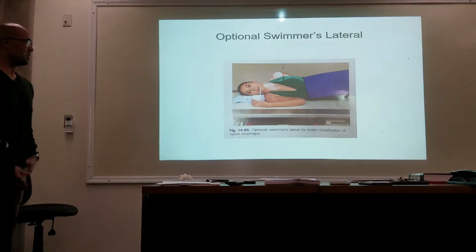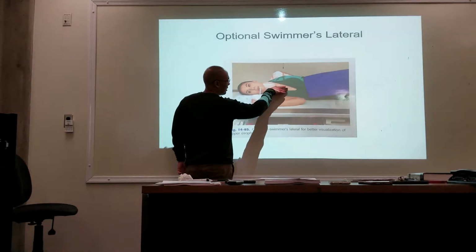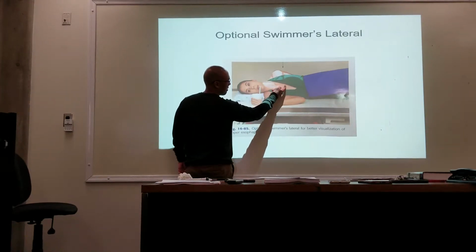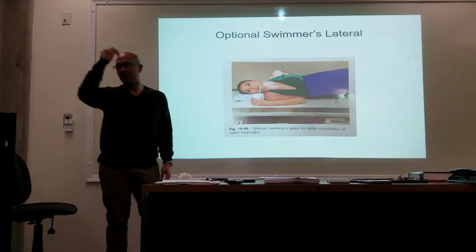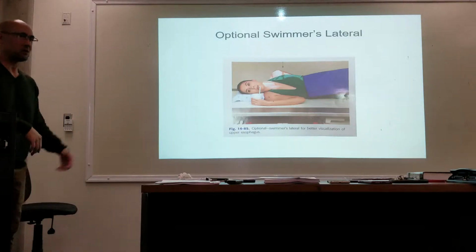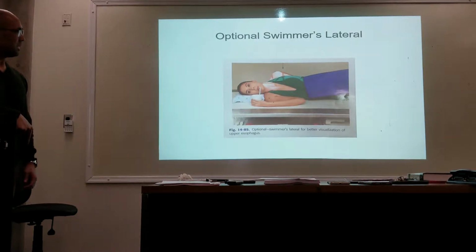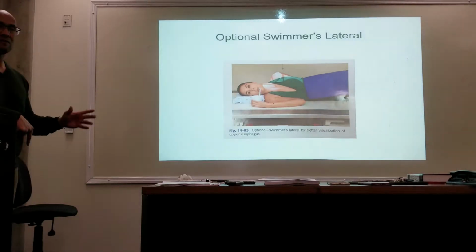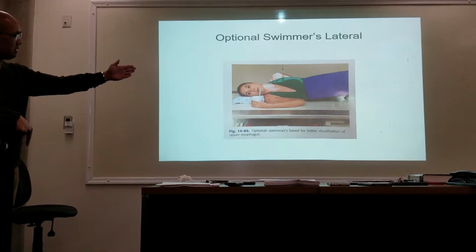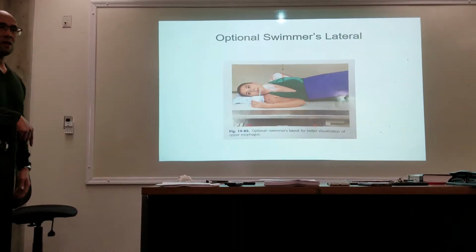Same thing applies, okay? So what you're going to do now is you're going to center just slightly about an inch and a half off the mid-sagittal plane. So find the mid-sagittal plane and center about 1.5 inches on the upside. It's almost like that RAO. This is almost like an LPO, you guys agree? So from the mid-sagittal plane, you're going to center about an inch and a half off. Okay? Same level, T5, T6, so put the top of the cassette image receptor 2 inches above the shoulder. And again, drink and swallow. Okay? Make the exposure.